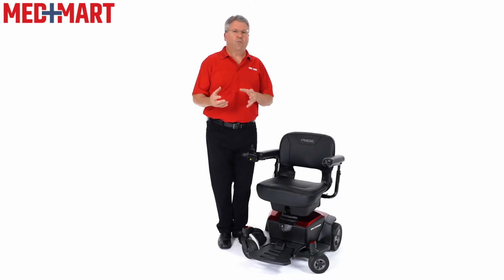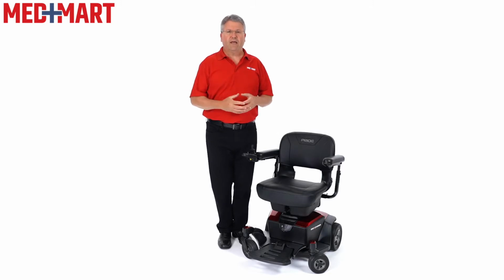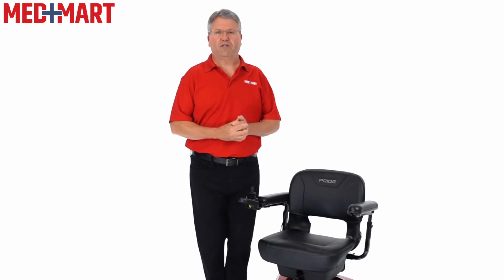So it really depends on the weight, how you're using it, if you're doing a lot of inclines, or if you're going full speed all day. Just keep that in mind when you're traveling. If you're halfway through the day and you need to stop, hook up your charger, charge it up, and you should be good to go for the rest of the day.